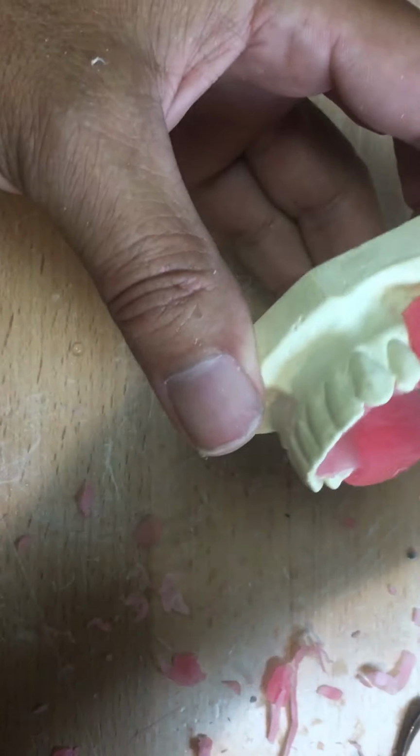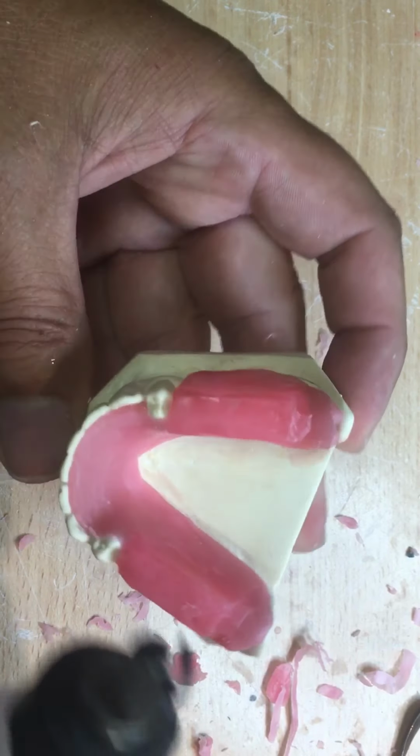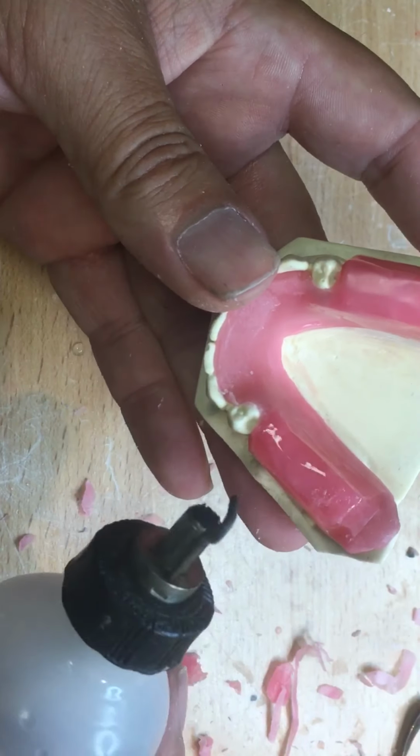We'll put this back on the model. And then here we can finish it up, make it smooth. A little alcohol, a little. Too much will spoil the business there.